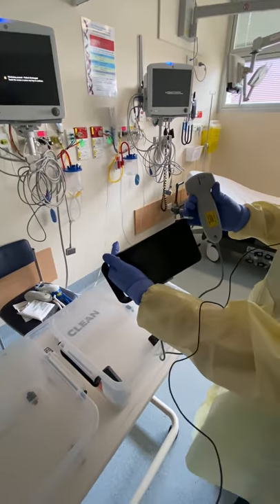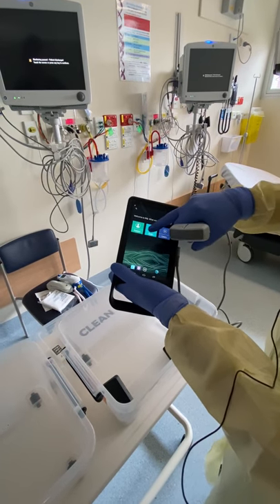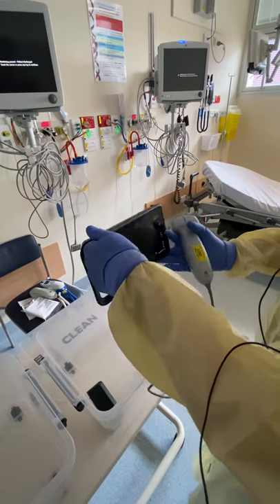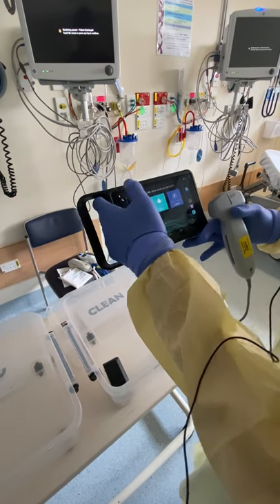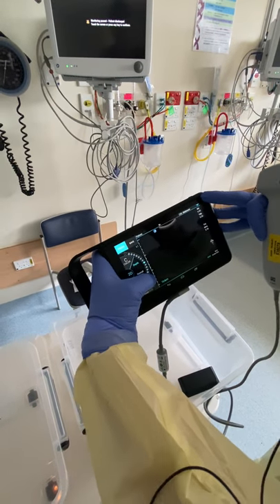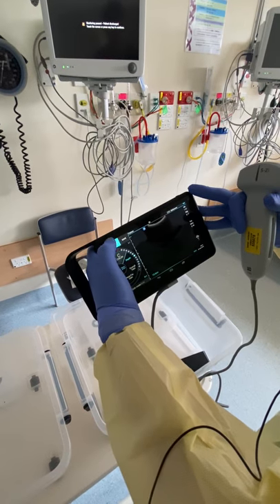The iViz comes with a curved array transducer and a portable handheld unit. To unlock the screen you slide it to the side, then to scan just press scan. This doesn't have a lung preset, so just use the abdominal preset. You can adjust depth by pressing on the side scroll wheel to bring it to a deeper depth, or the minus button at the top to take it to a shallower depth — usually about 10 to 12 centimeters is about right for a lung scan.